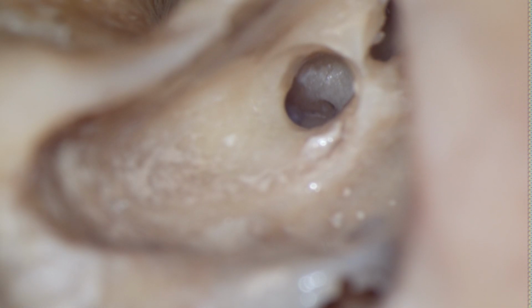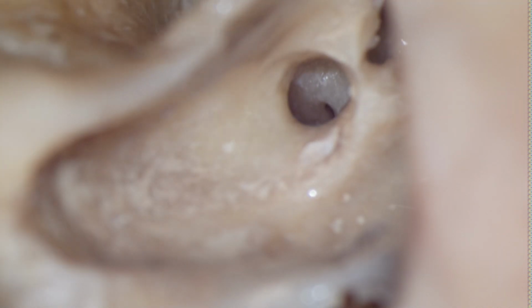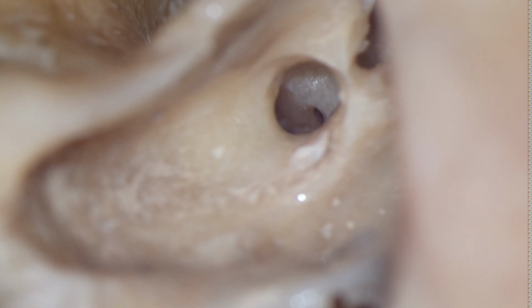And for cochlea, this is a large burr. So for doing a cochleostomy, or an extended round window approach, you need to have a cochleostomy burr. We don't have that. So basically this is the point where you drill. You have to drill the lip of the round window so that it becomes flat and two-dimensional. Right now it is three-dimensional, and there is an overhang basically. So you drill, remove the round window membrane, and then insert the implant. So that is the point.